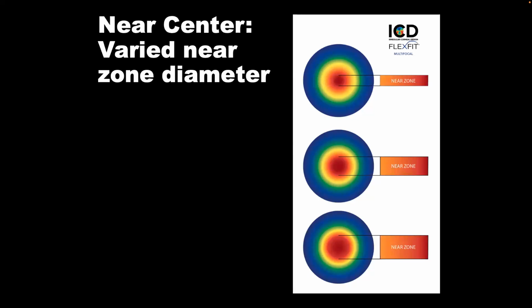Just remember that when you are fitting a multifocal, you need to have three basic things: a good centration, good disposition, the patient being very flexible about using multifocals, because the learning curve could be very steep, and they could feel less motivated to try it, because they can be very susceptible to the changes in vision.